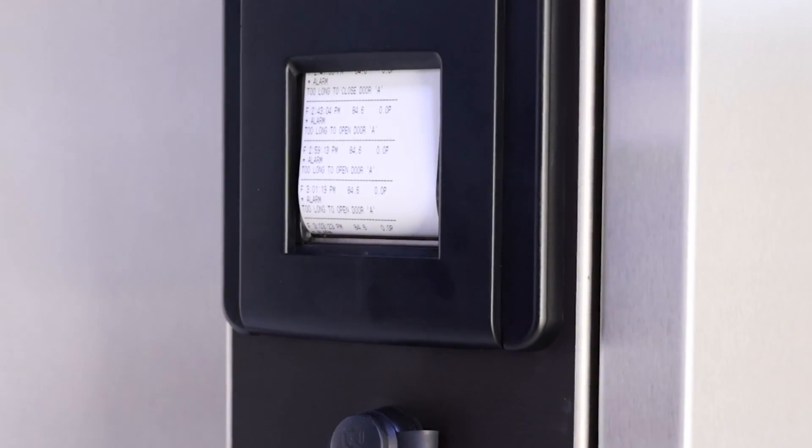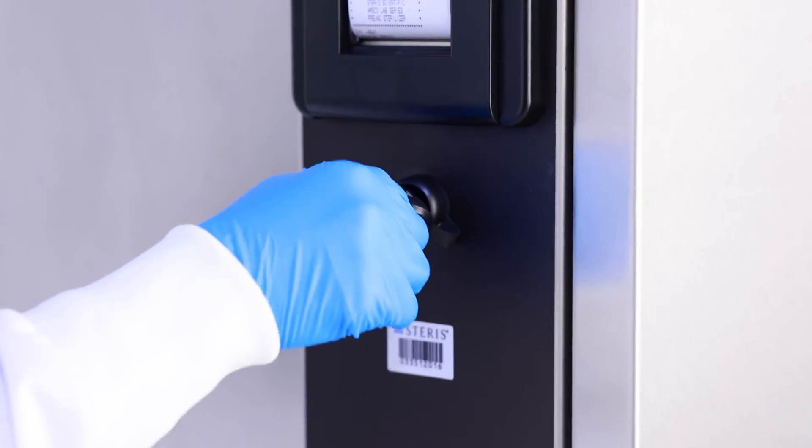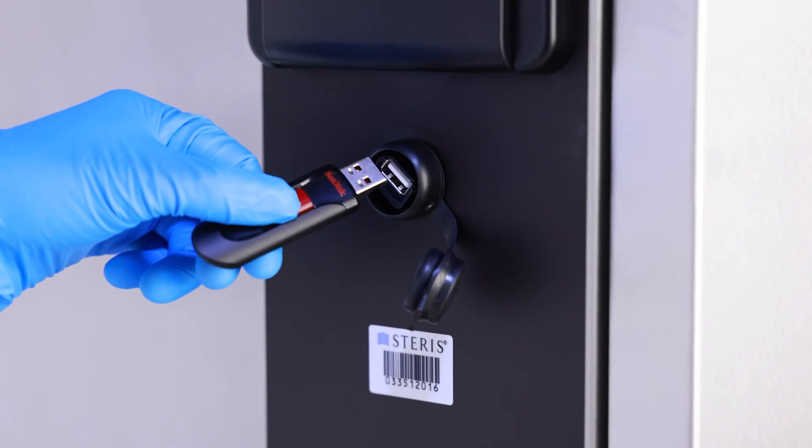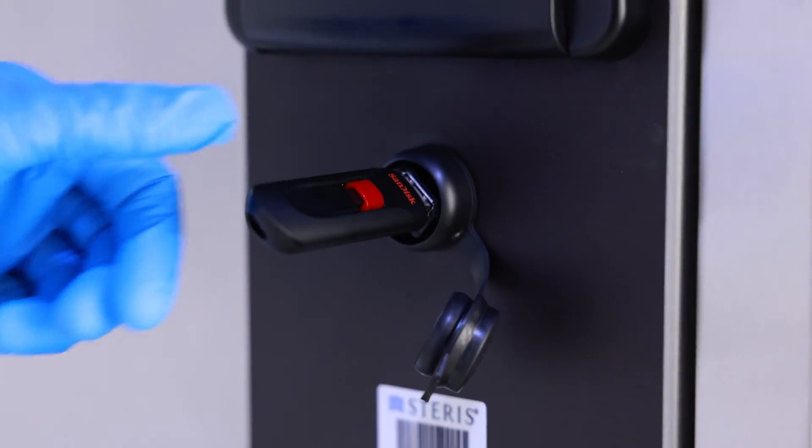Cycle data can be printed using a standard printer, electronically saved on a regular USB drive, or exported via an RS-232 port.